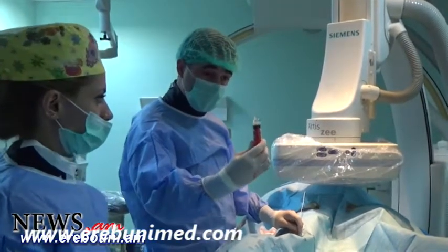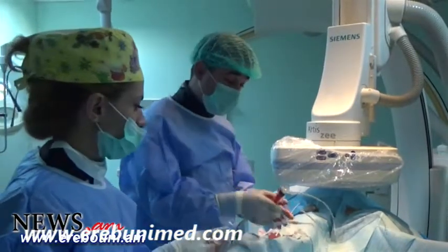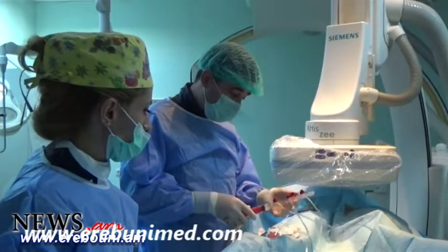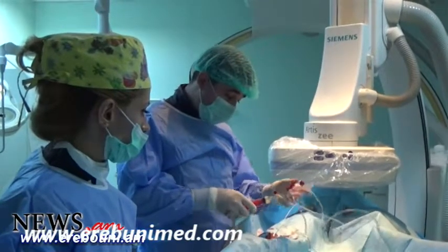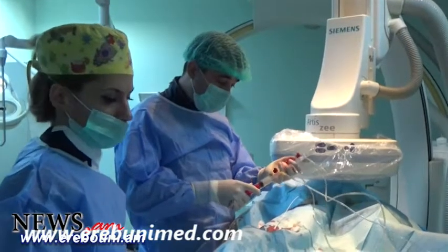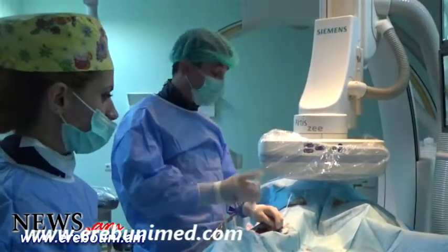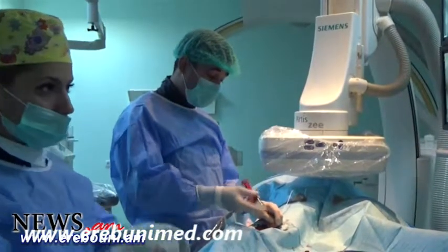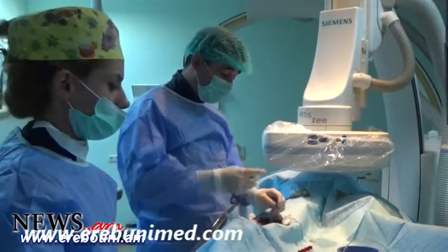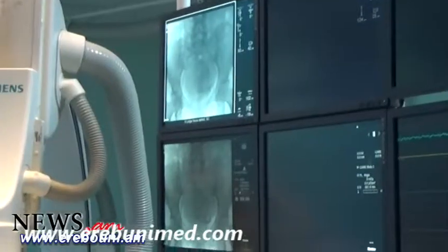For this intervention, we choose a solution from Embosphere, which are balls of different diameters. In this case, we use balls sized 500 to 700 microns.